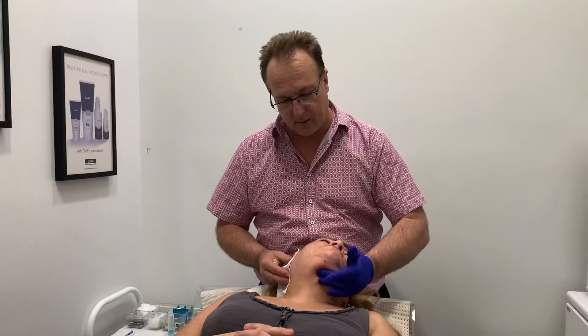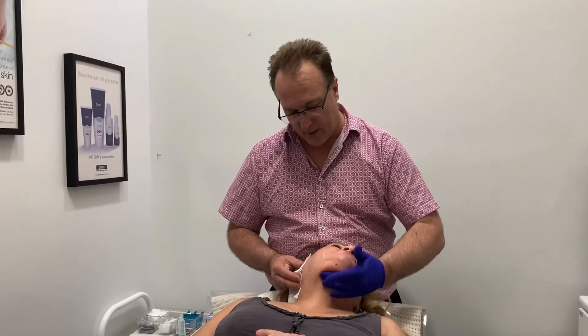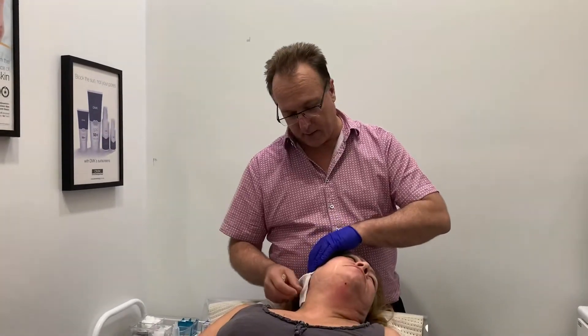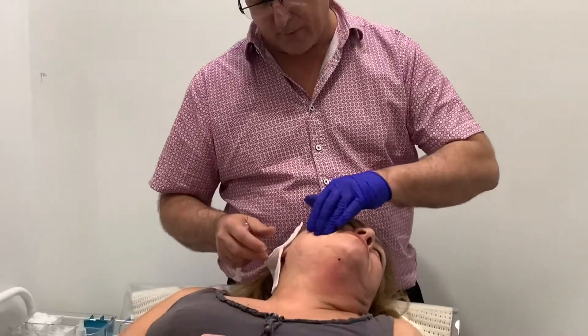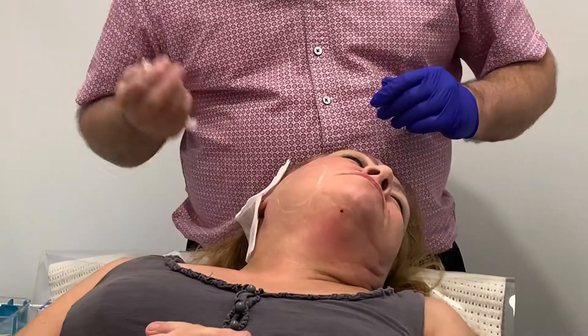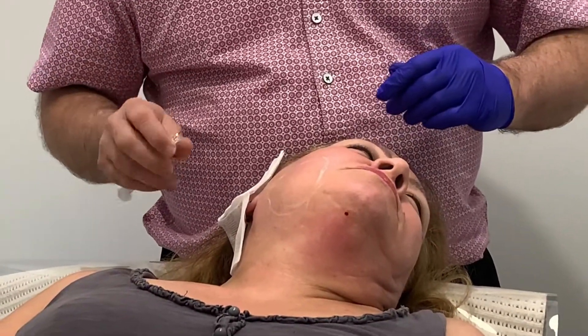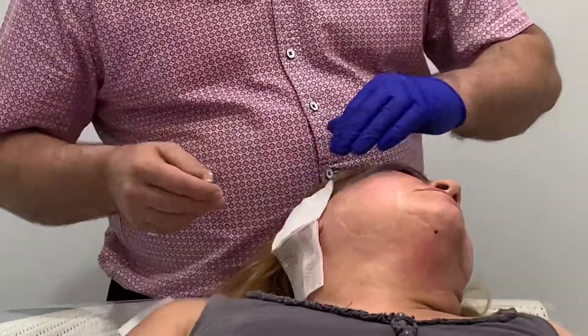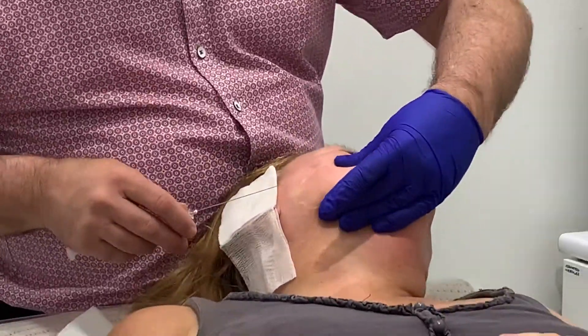So we've treated the submental area with the cannula. I'm going to use a sharp needle now. I've marked the area that I'm going to be doing. I don't want to come too far up here, but I'll be using a sharp needle — fairly long needle. It may look like it's going to be sore, but in actual fact the sharp needle is less sore than the other areas.